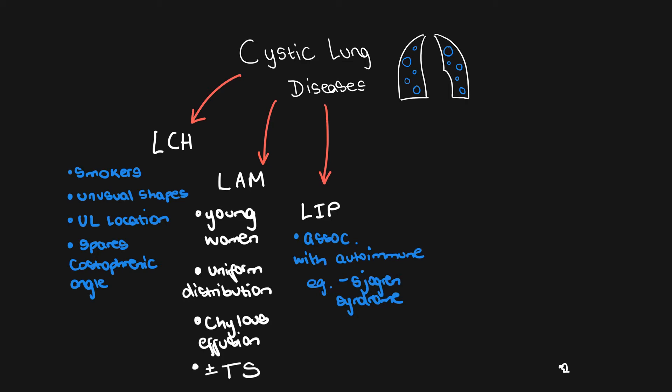The next differential to think about is Lymphocytic Interstitial Pneumonitis, or LIP. This has slightly less specific appearances than LAM and LCH, but clinically it's associated with autoimmune diseases like Sjögren's syndrome. You can also get ground glass change and reticular nodular opacification with this disease.